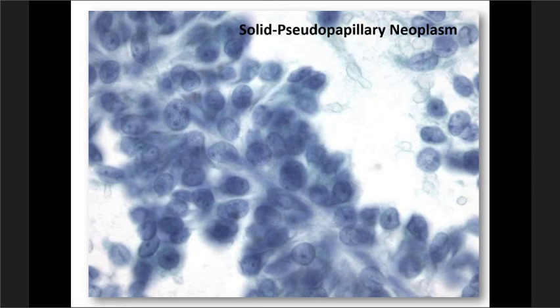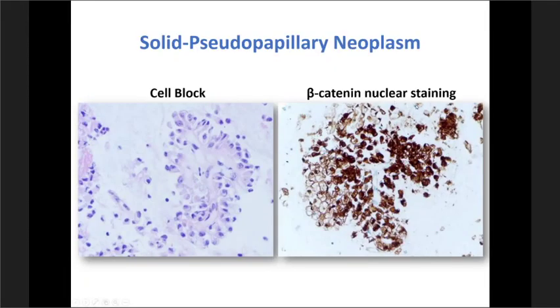The staining that I would recommend is a beta-catenin. It's a nuclear stain, and that should confirm your diagnosis. Remember, these tumors can, in about 20% of cases, be positive for synaptophysin or other neuroendocrine markers. So it's a known pitfall. So look at the case carefully and don't make that mistake, please. Remember, mitotic activity is also another helpful key here. These will be slightly more mitotically active than a low-grade pancreatic neuroendocrine neoplasm.